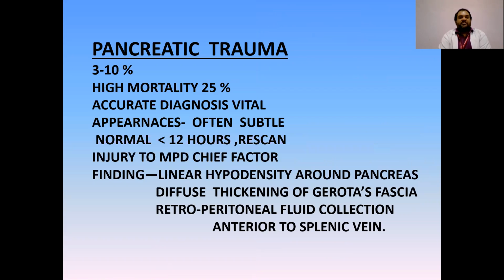The appearances of pancreatic trauma are often subtle and they may be normal if the patient presents within 12 hours, then we should rescan. We should look out for the injury to the main pancreatic duct, which is the chief factor. Findings: the linear hypodensity around the pancreas, diffuse thickening of Gerota fascia, retroperitoneal fluid collection anterior to the splenic vein.